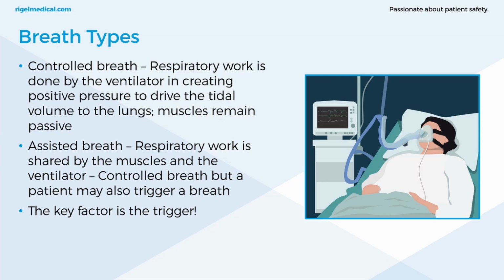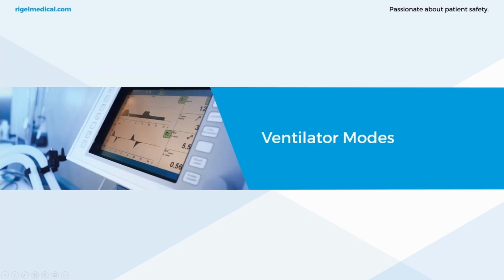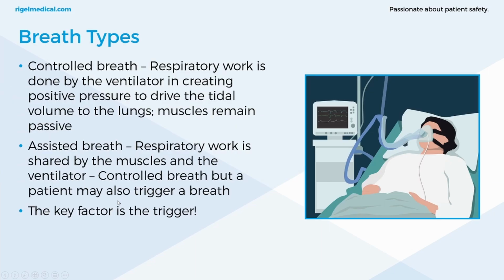Assist control in assisted breath is another common example. So you've got your mandatory breaths per minute, like with the volume, but we also spoke about the trigger sensitivity. So what the ventilator takes as the trigger for delivering a breath or pressure support to the patient. So if a patient tries to take in a breath, the ventilator will then deliver an additional breath at a set value.